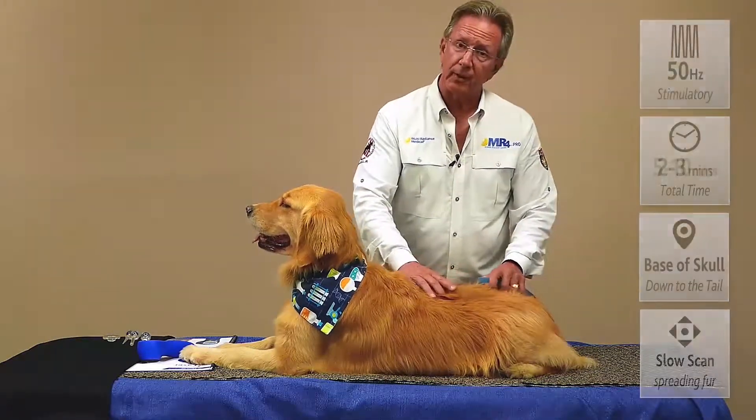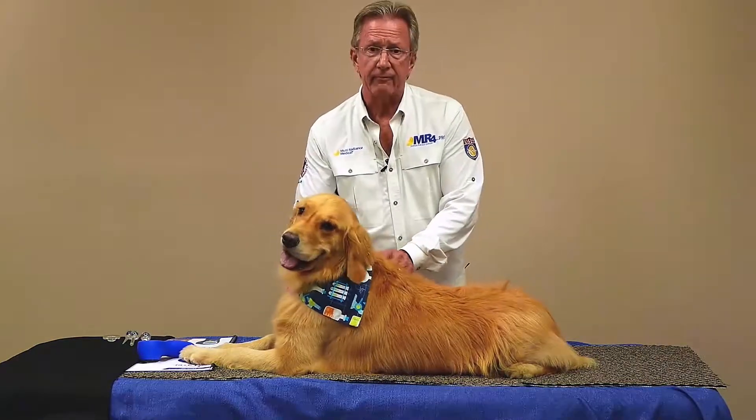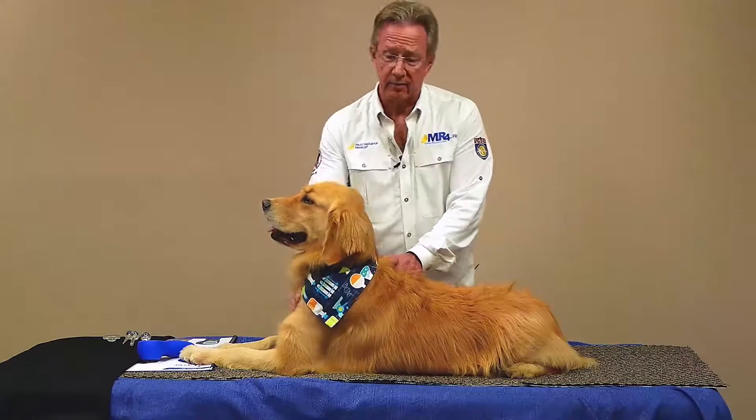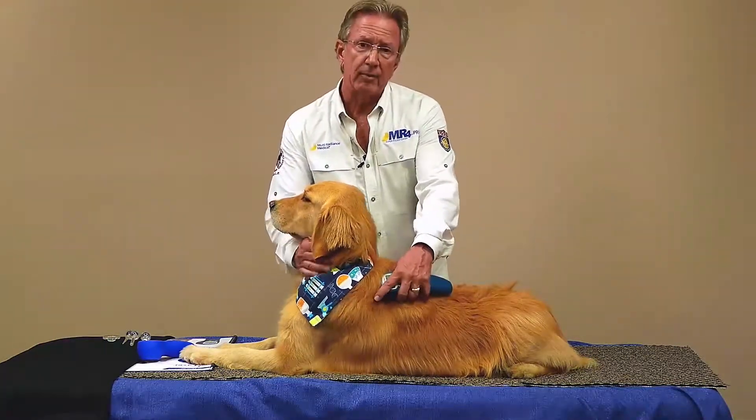With an older dog, this variation to stimulate along the spine is also terrific. You're hitting those bladder meridians right through here if you're in the acupuncture world, and it just has wonderful beneficial effects. Nice that it has no side effects — no side effects from laser unlike a lot of drugs. So that's the unwind protocol, which is always a great place to start.